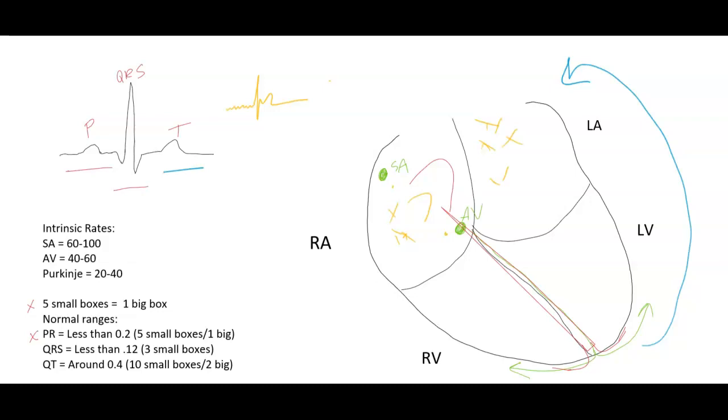If there's something wrong with the P wave, we know that there's something probably wrong in the upper level of the heart, in that atria, in the intrinsic pacemaker of the SA or AV node. That's some sort of atrial arrhythmia. Makes sense, right? If there isn't that cute little jump, the SA and AV node aren't connecting right. Now let's move on to another one.